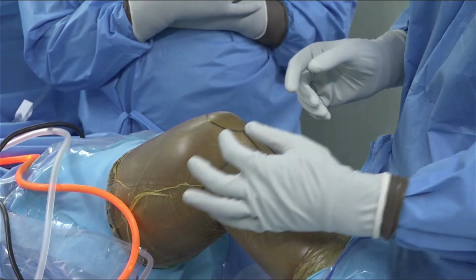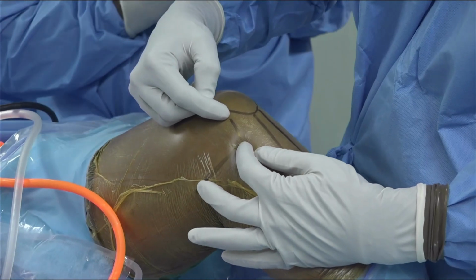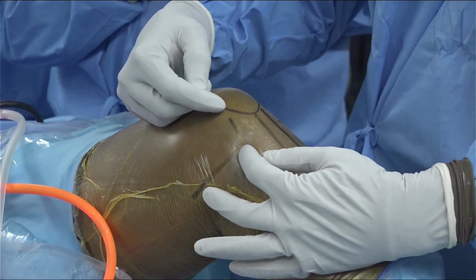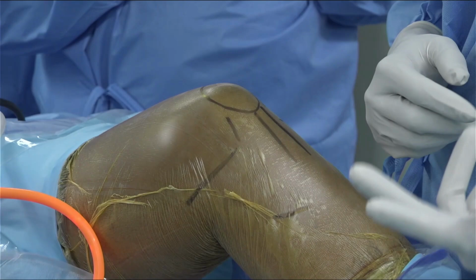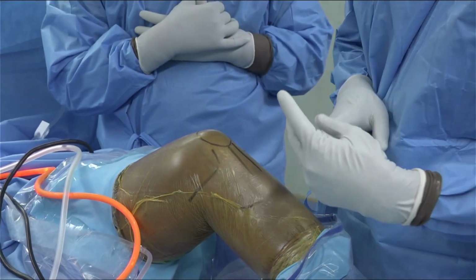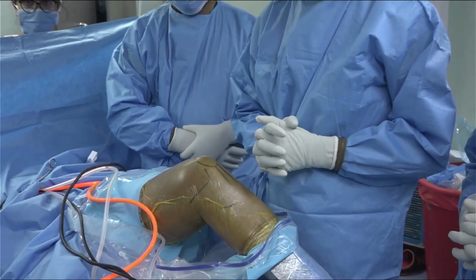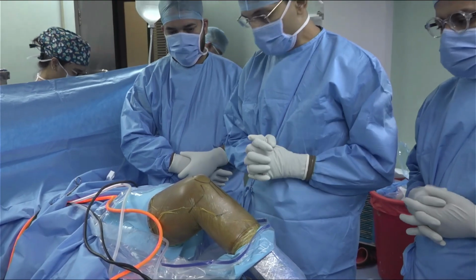So we have started making a single portal which is a little bigger in size. We will make around a 1.5 to 2 centimeter single portal on the medial side, which will work as both the medial portal and the anteromedial portal. So we can actually use two instruments simultaneously through that portal. That is another advantage that we have with this kind of a system.